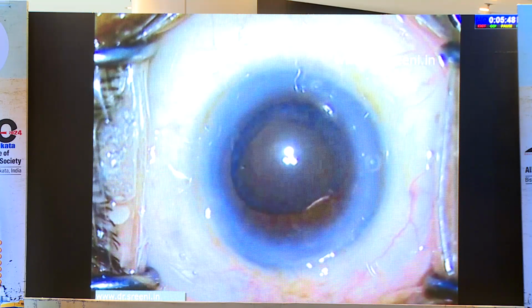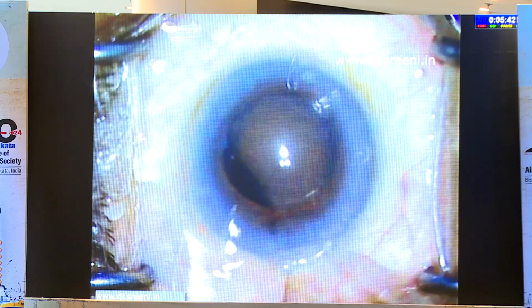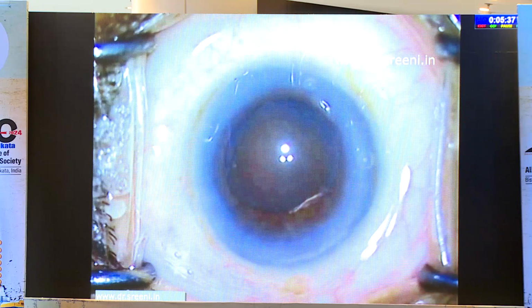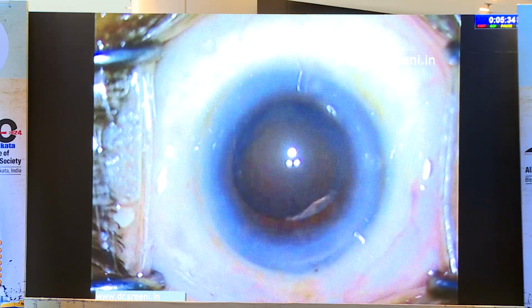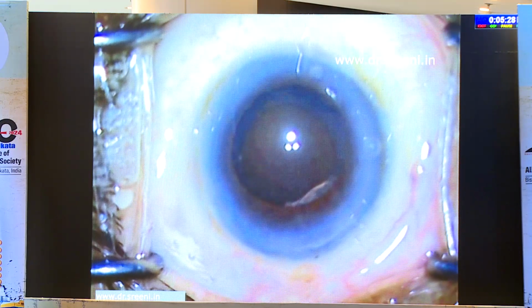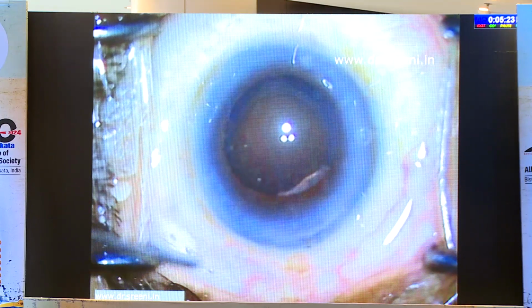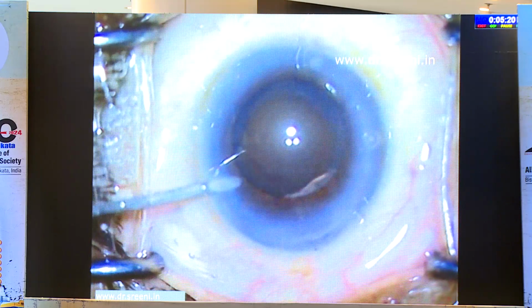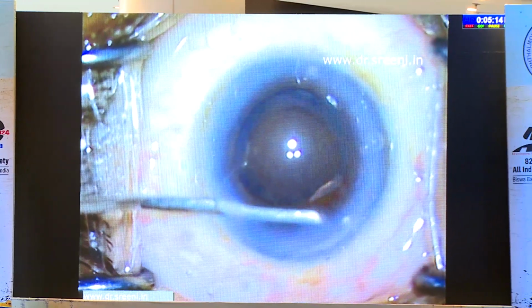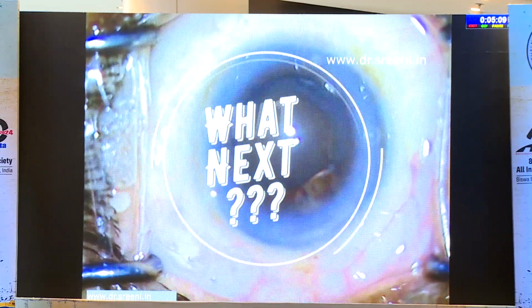One is suprachoroidal hemorrhage, which was ruled out in this case and all the other cases I mentioned. The other possibility is that the fluid has got misdirected and it has gone through the zonules into the potential space between the posterior capsule and the anterior hyaloid. That's a potential space called the Berger space. Probably why I'm getting more than normal of these hard eyes is because I do the surgery with a very high bottle height. So when the bottle height is very high, or if you are doing surgery with high IOP, there is a higher chance that it goes in.